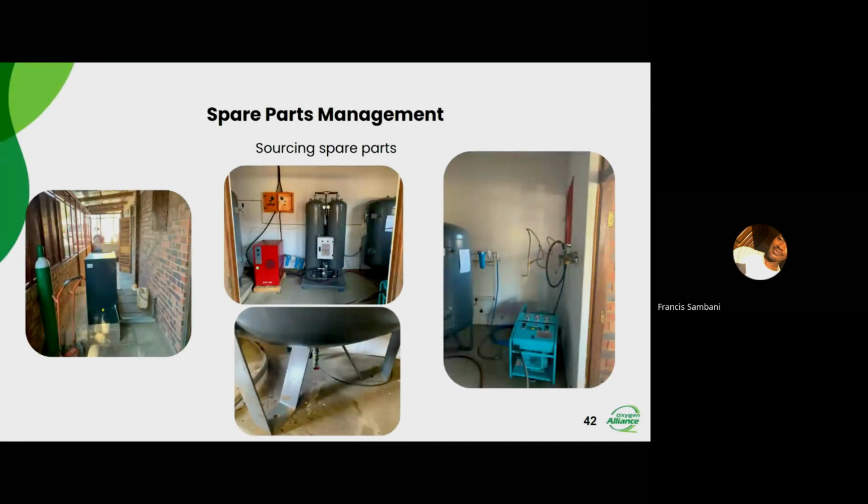So we had to arrange this whole system, having the air compressor, and after the air compressor have an after cooler. The after cooler just helps to cool down the temperature of the air. It does help reduce moisture, but not 100%. Maybe it's a good percentage, over 50%. And then after that we had to change the air dryer, which you can see on the middle upper picture, the red thing. That's the air dryer.